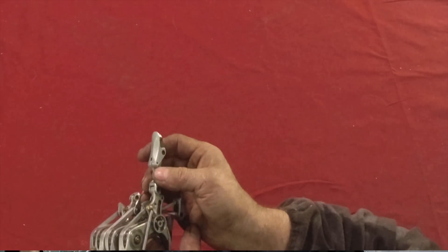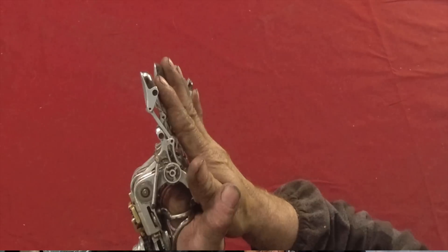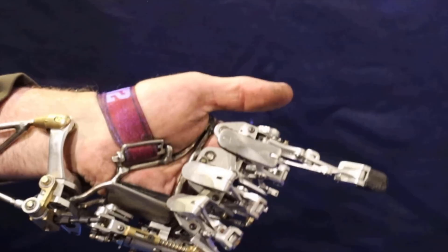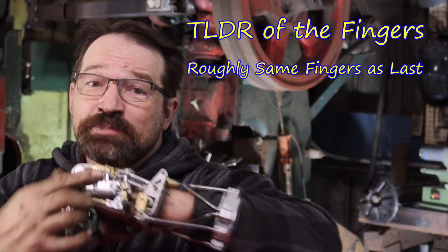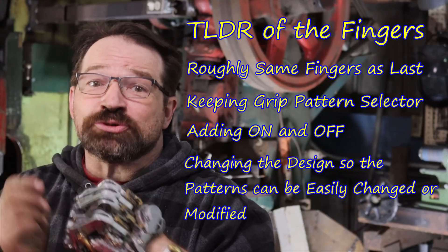Moving on to the fingers. I really like the fingers from my current hand — the asymmetry, the minimal design, combined with the way they articulate, and the similar dimensions to my natural fingers make them a definite carryover to this version. Another carryover from the previous hand is the ability to cycle through grip patterns. During the time I've been using the 158 hand, I've really enjoyed being able to cycle through different grip patterns depending upon the situation. That being said, it would really be nice to be able to turn that function on and off as needed. I'd also like to be able to easily add, remove, or change the order of the available patterns. So the TLDR: using roughly the same fingers as this hand, keeping the grip pattern selector, adding the ability to turn it on and off, and changing the design so I can easily switch the available grip patterns.